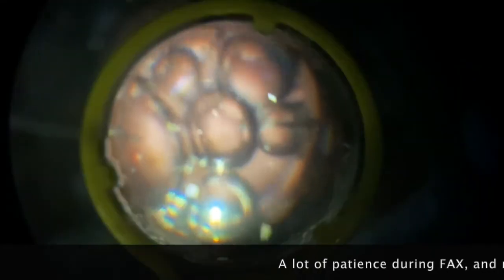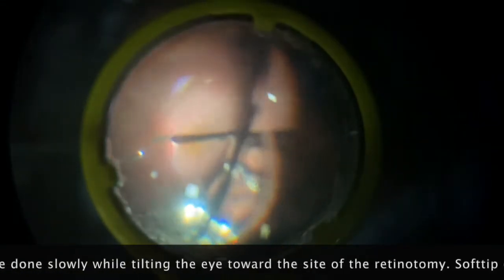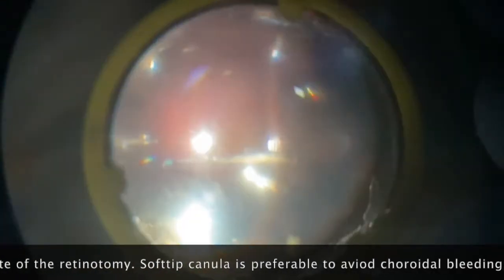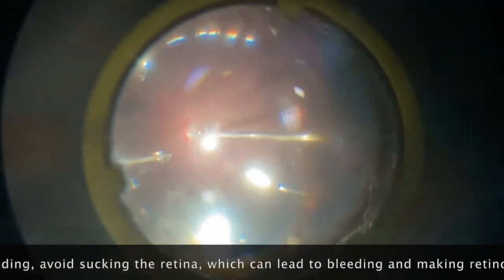Here I'm applying diathermy so that I can see it very well. In situations like these where the breaks are at the periphery, I prefer to do a retinotomy for my air-fluid exchange. I will choose an area where there are no visible blood vessels, about three or four disc diameters from the disc periphery at the site where the primary break is. Very important at the nasal side so that in case there's a bleeding, it doesn't go under the fovea — that's very important.